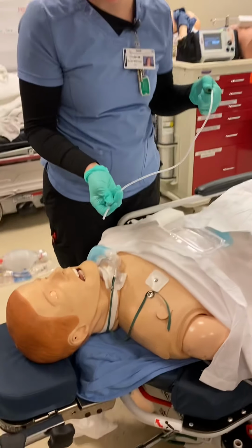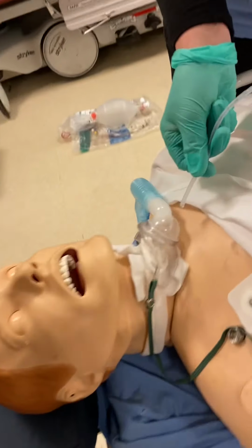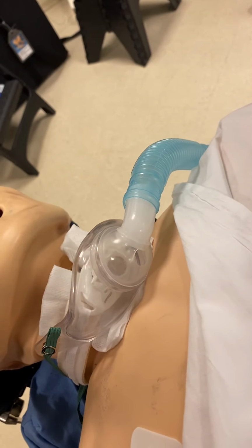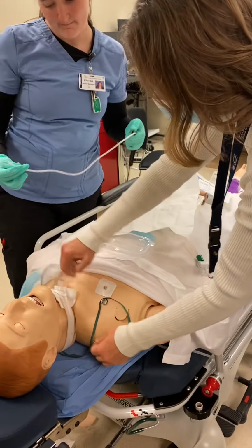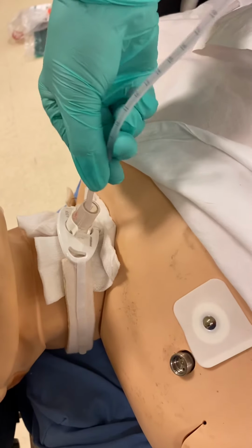I'm gonna tell the patient that we're gonna suction down. You can actually suction right through the trach mask. But if you're worried about being sterile, then you would have that removed. So I'm gonna have you at least remove this for me. And you're just going to twist and go down.